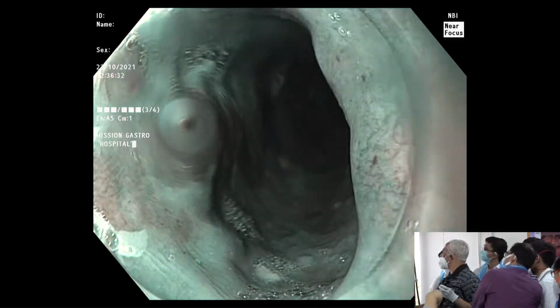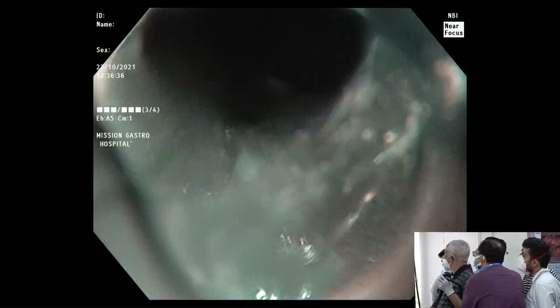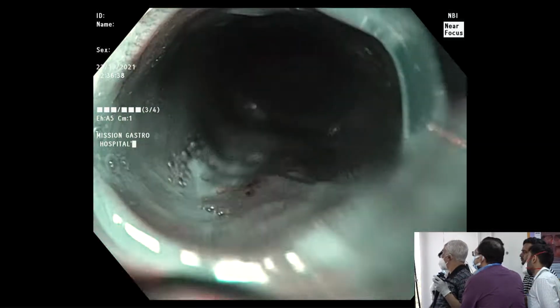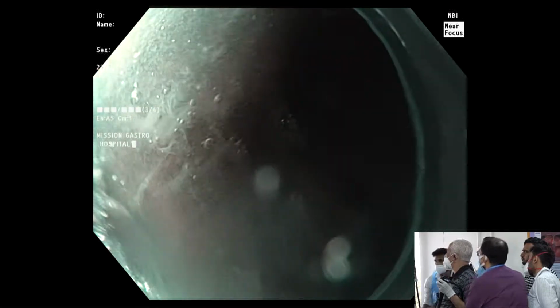No, these are not looking neoplastic to me. I think we're getting that focal thing because some kind of membrane thing is sitting on that.